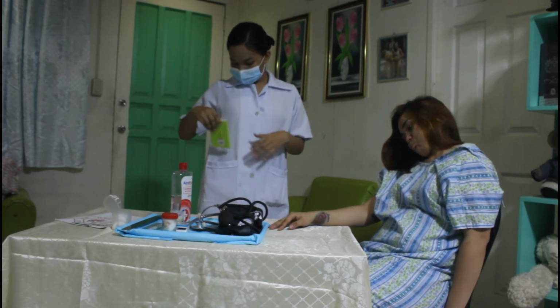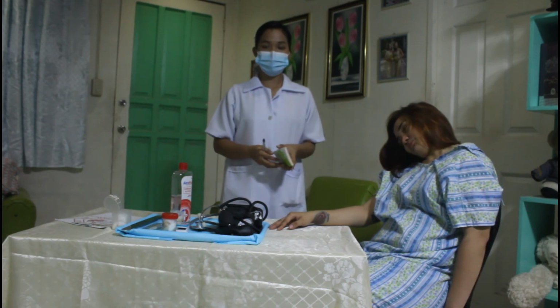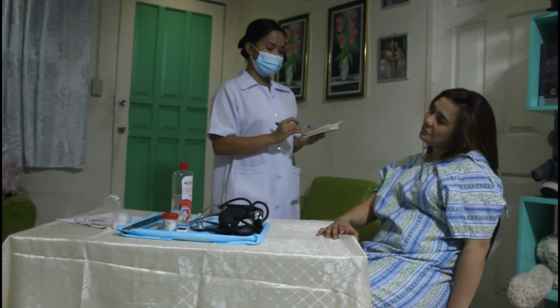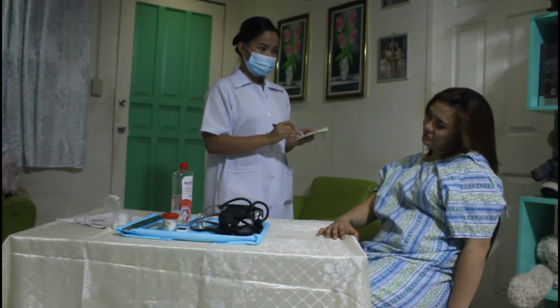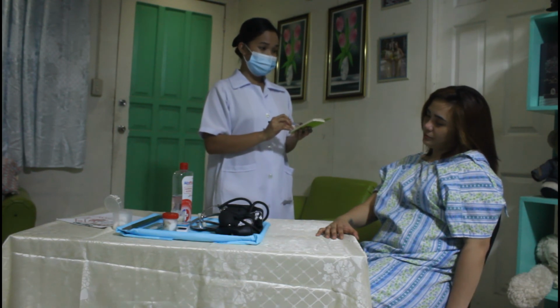So, after all the procedure, then we discuss the findings with our patient. So, ma'am, your body temperature is 36.7. Your pulse rate is 87.